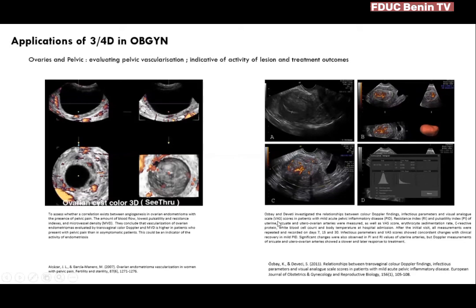And also one study by Osbey suggested that 3D, 4D combined with power Doppler can help us to understand treatment outcomes in pelvic inflammatory diseases.